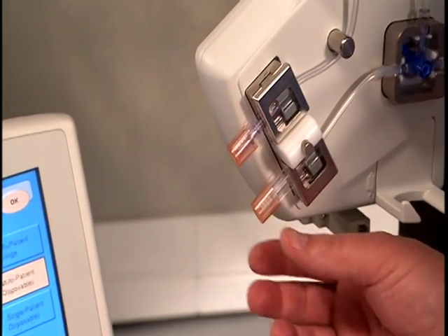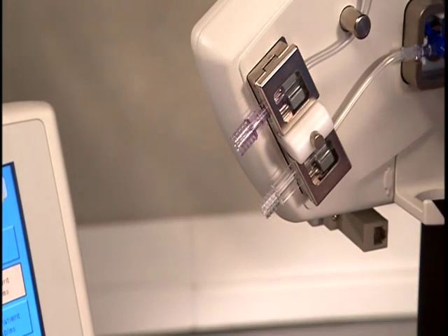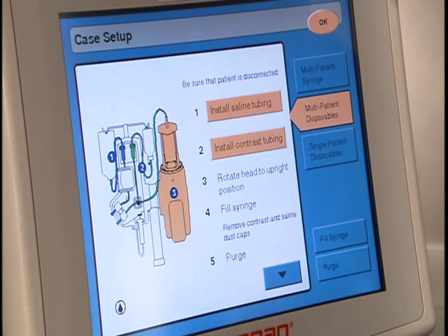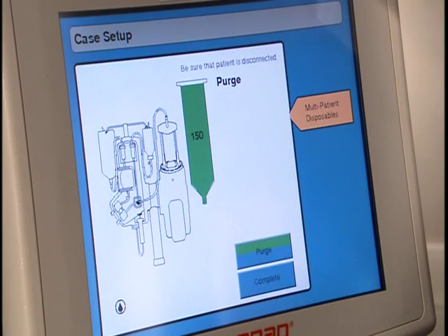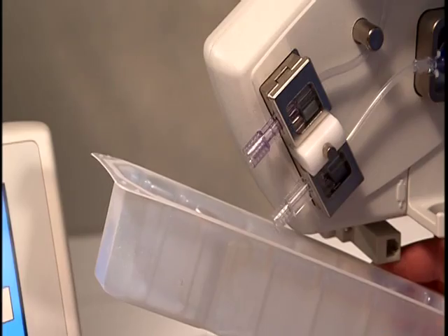Remove and save the sterile dust caps from the contrast and saline multi-guard connectors. Keep in mind that anything covered by an orange cap is sterile and needs to remain sterile. Perform Step 5 by touching Purge. A graphic representation of available options is displayed on the screen. Both contrast and saline fluid paths will be purged simultaneously by touching the Purge button.